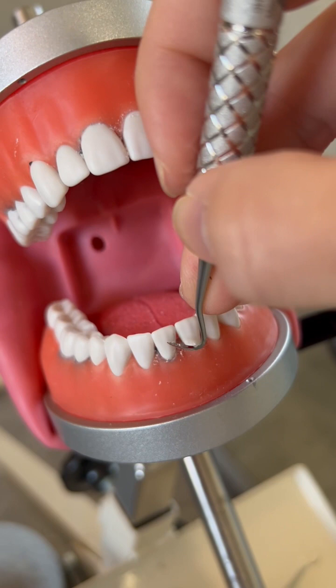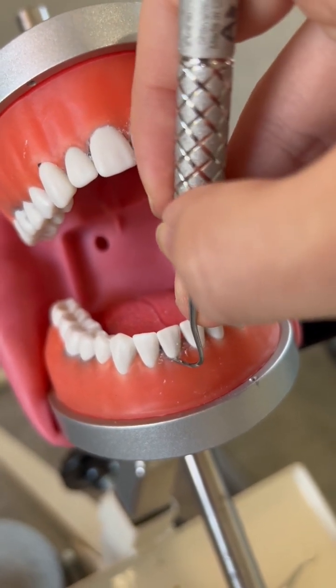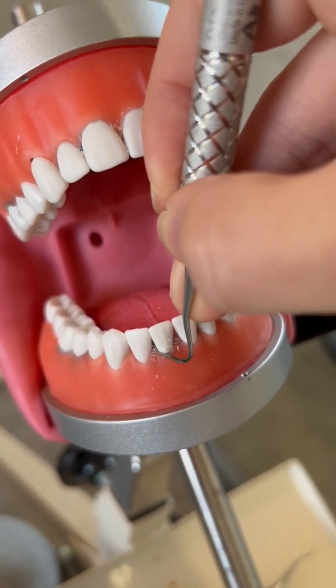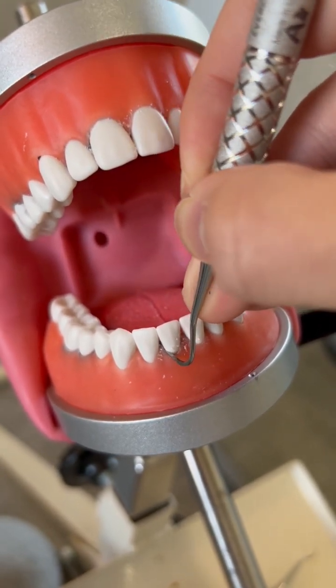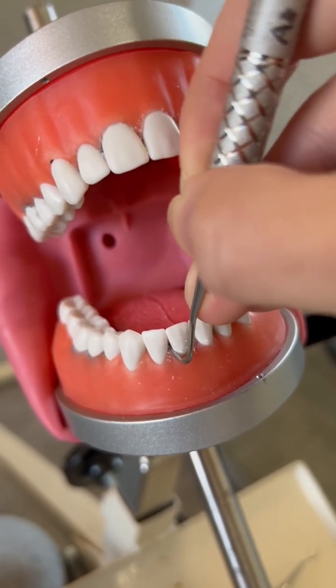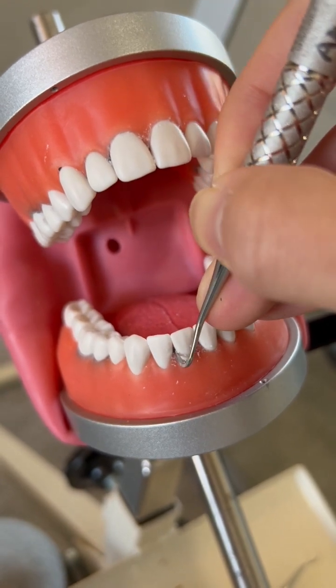Same with tool number 25, face surfaces towards. Start at the midline, side to side, pivot and roll, side to side, pivot and roll, and only go half of the interproximal space.